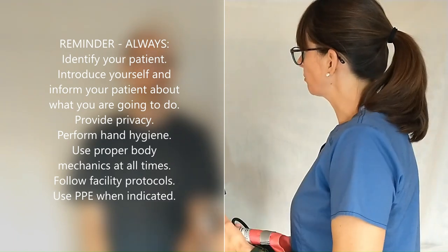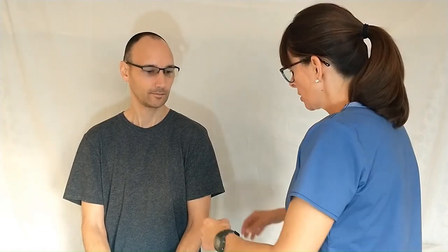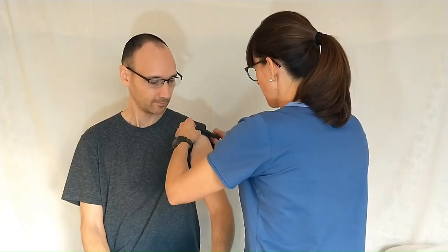I'm going to take your blood pressure. Is that okay? Can you tell me what your normal blood pressure usually is? It's around 120 over 70 or something. Okay, thank you. So then we'll roll the patient's sleeve up.